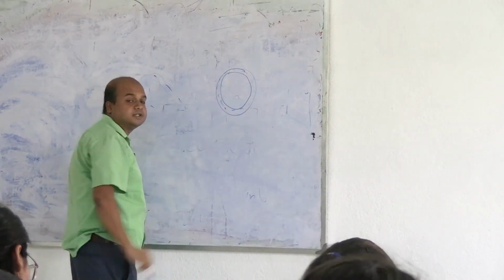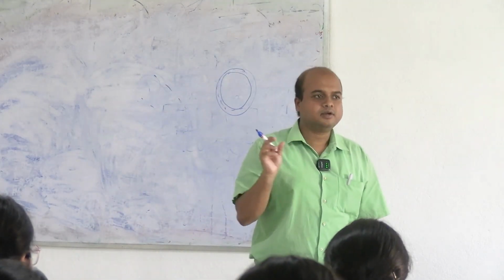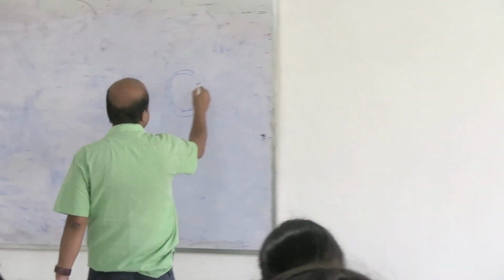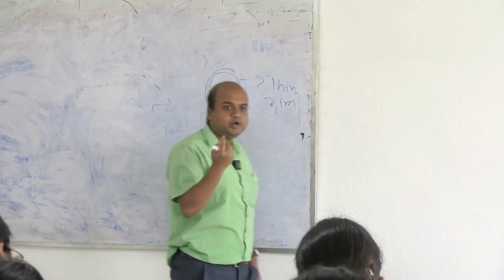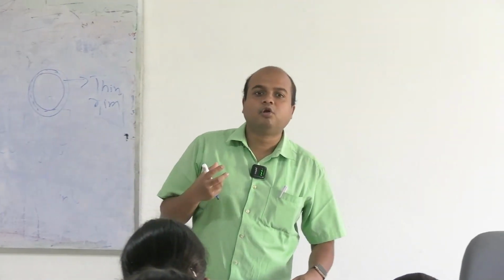So the nucleus is almost the whole of the cell, and the cytoplasm is just surrounding it. This is described as a thin rim of cytoplasm surrounding the nucleus. Thin rim of cytoplasm. Rim is this rounded portion, thin rim of cytoplasm. Okay, so lymphocytes are rather easy to identify. This thin rim of cytoplasm outside the nucleus, and the round nucleus covers almost the whole of the cell.